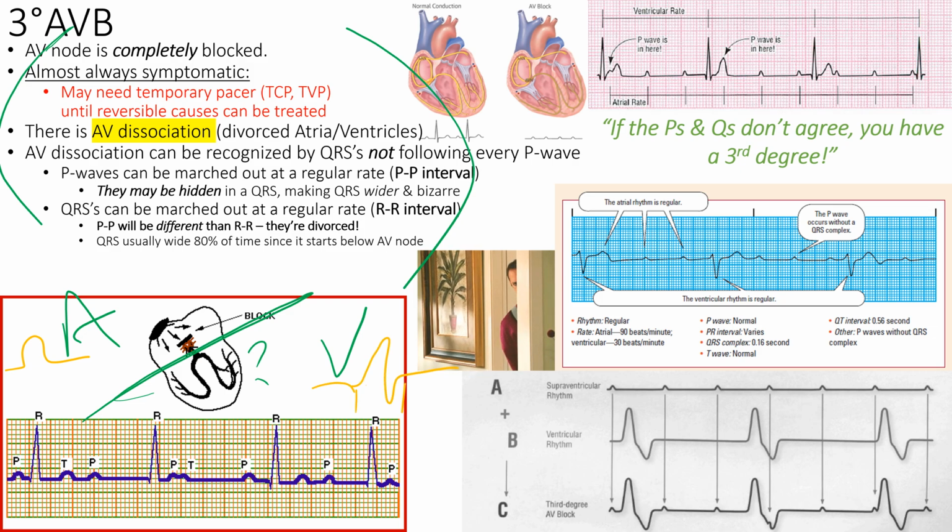And that'll make sense when we talk about idioventricular rhythms, because idioventricular rhythms are wide because they come from the ventricles, right? So any rhythm that comes from the ventricle is wide. If it went through the normal pathways, the normal highways through the whole heart, then it's going to be a narrow complex. Yeah, with a little caveat. If it's a bundle branch block, yeah, it could be wide too. We're not going to get complicated like that.